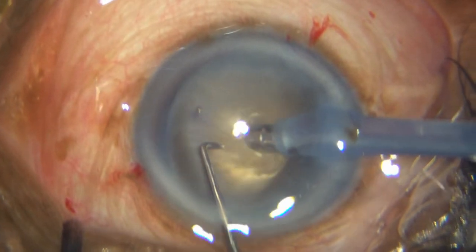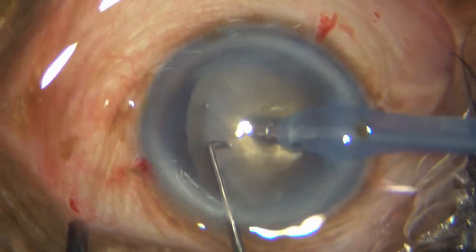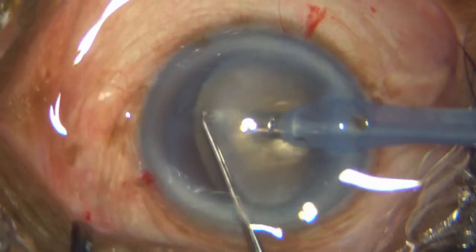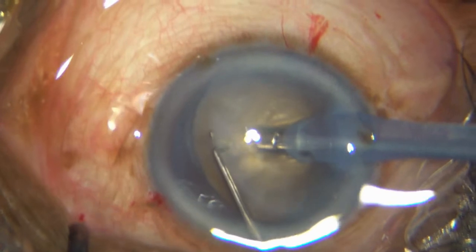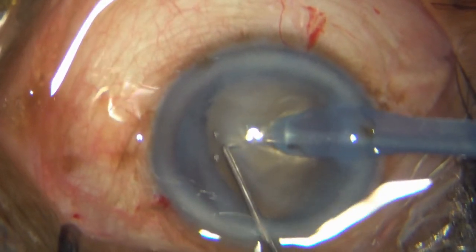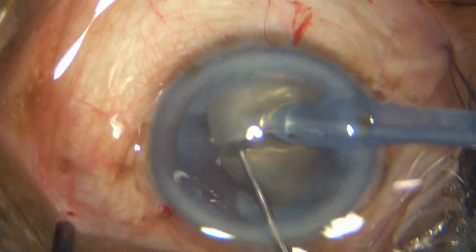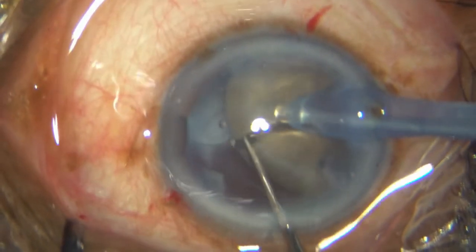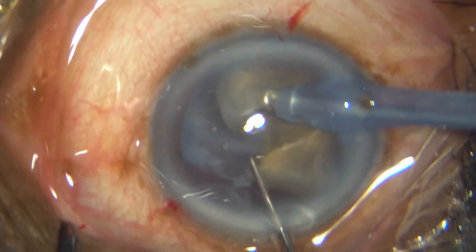You can notice how mobile this nucleus is. But the moment you have a two-point fixation, you can fix that nucleus. With this woodcutter's technique, it's a little more peripheral than I would have wanted with the chopper, but I am able to nicely separate it.